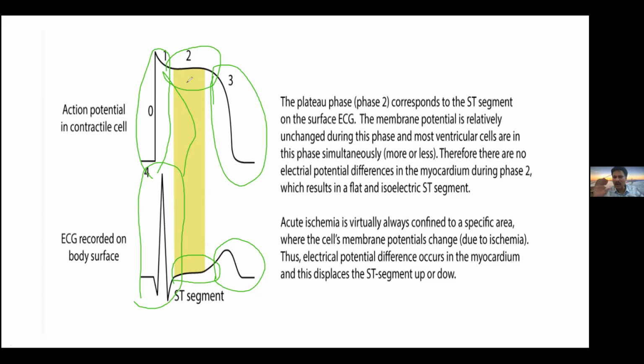When all the areas of the heart are silent and no activity happens, there is an isoelectric ST segment. When there is ischemia, you will find ST segment elevation if there is transmural ischemia. If there is subendocardial ischemia, there is ST segment depression.